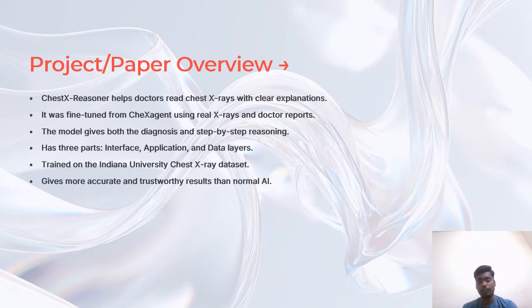So, the project focuses on using artificial intelligence to help doctors read and understand chest X-rays easily, along with clear explanations for the results. Let's look at the project overview.